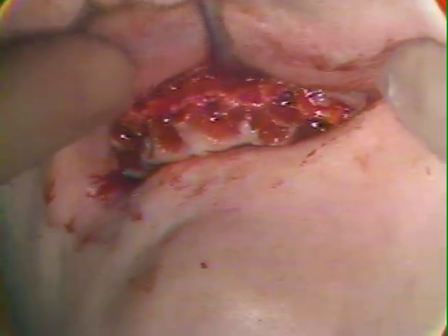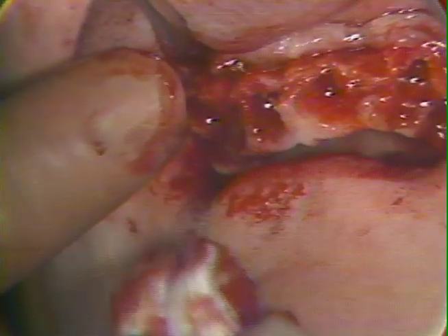So we now have those teeth removed, and I'll inspect the region by sliding the periosteal elevator underneath the flap to expose the entire labial surface. And we're looking for areas of sharpness, of undercut, and in general the contour is fairly good. Anything that's residual will be responsive to a bone file, which we will now use.